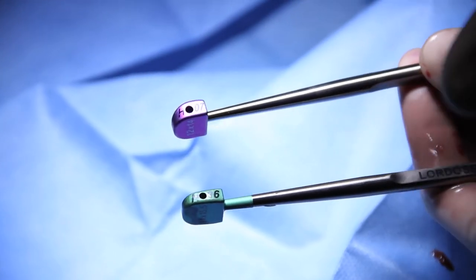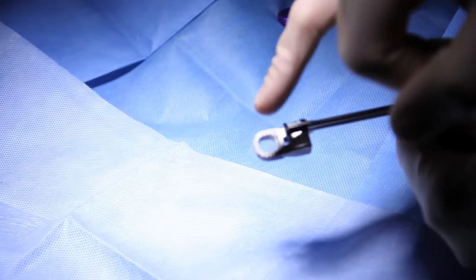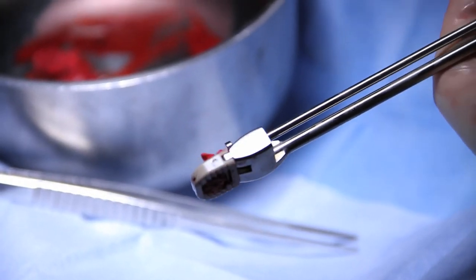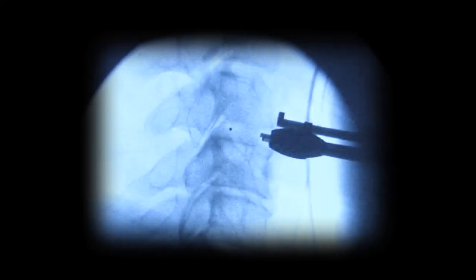The disc space is trialed for the appropriate size cage. The lordotic cage is selected to restore the normal curve of the spine. In this case, a 6mm height cage is selected and packed with bone grafting material, and then tapped into position into the disc space, restoring lordosis and the curve of the spine, confirmed by x-ray.